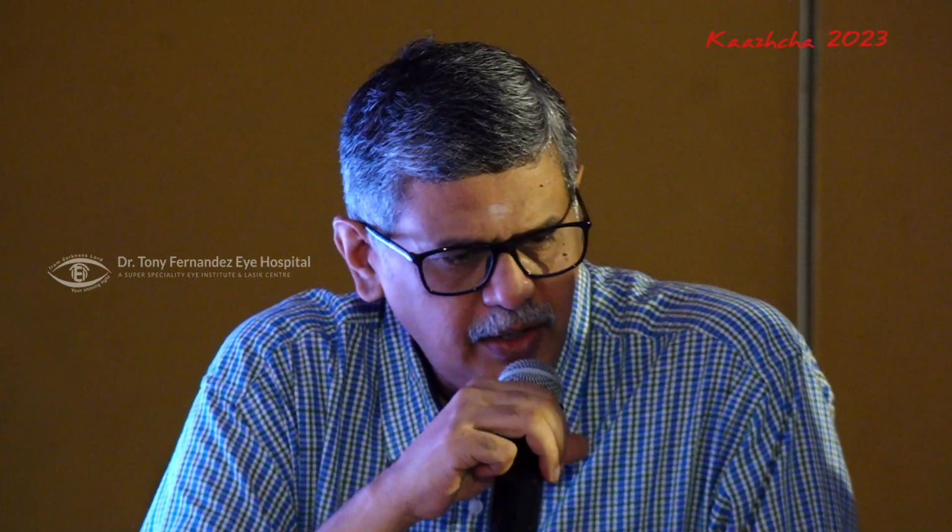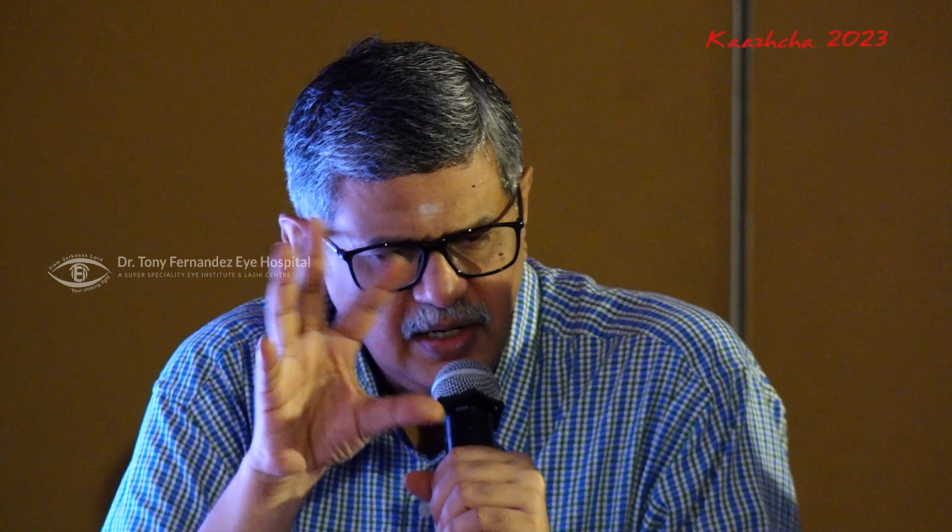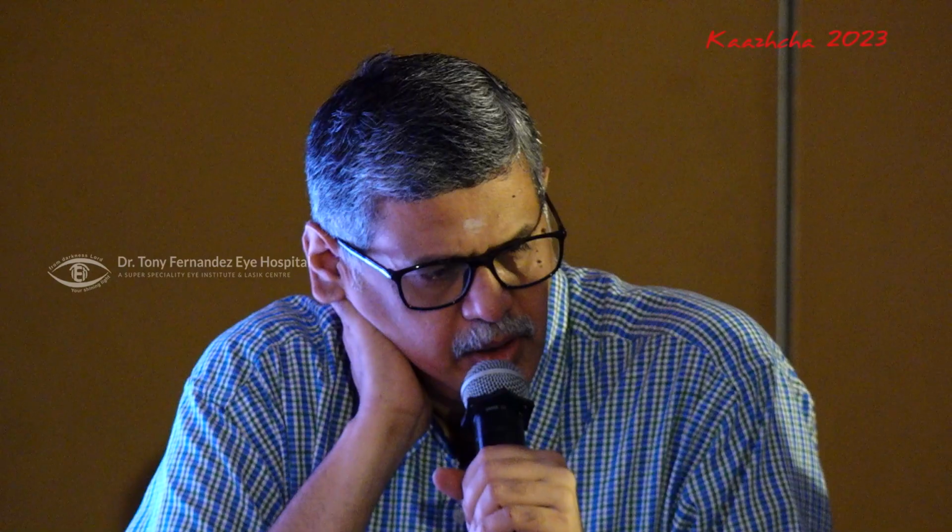When you start doing it, it's okay, but do you really find it useful when you look at a series of tests where you want to really look at progression? Sometimes the cluster of points at the central area are more darker in a C sort of program, and sometimes you tend to overestimate progression. Have you felt that way, Murali? And what is your comment on that?